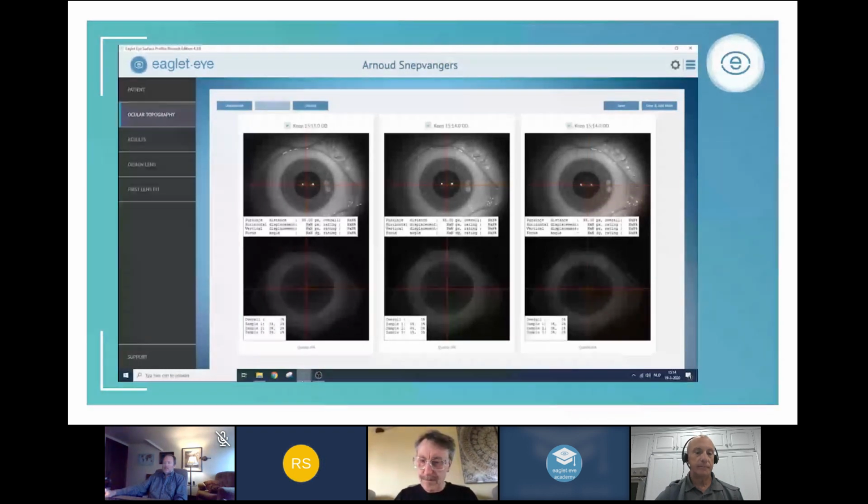Okay, I will move on. Are there more questions about the image acquisition? Rubikala Prakasam asks, why fluorescein to acquire images? We cannot capture an image of the sclera. So to take an image of the sclera, you need fluorescein to get a scattering light. Are there more questions about image acquisition?